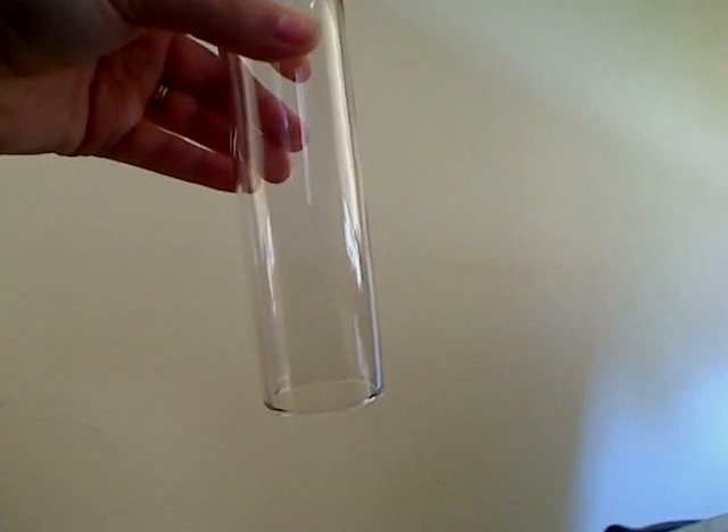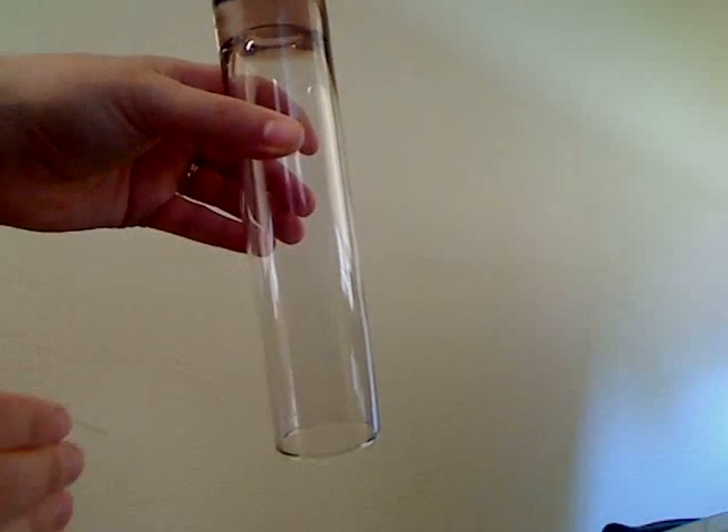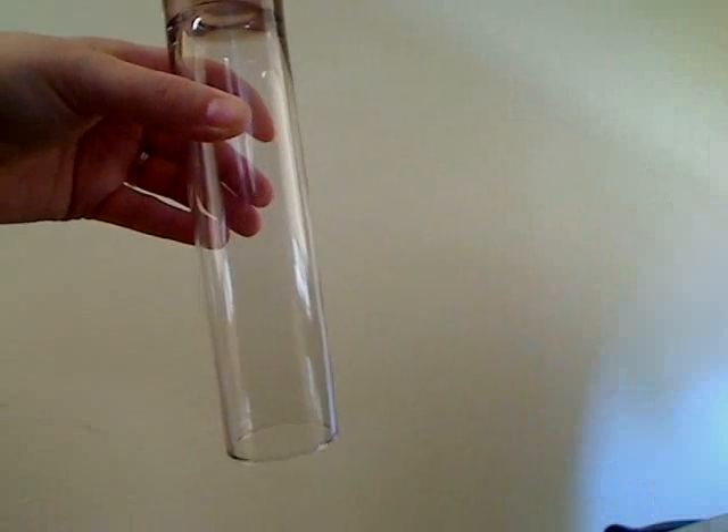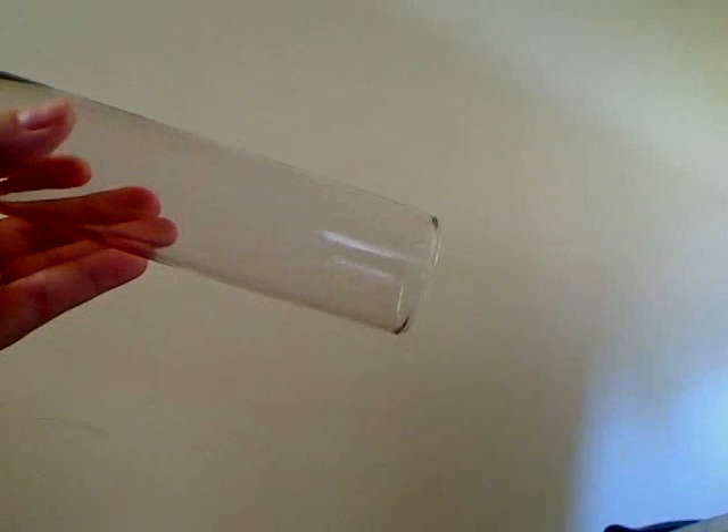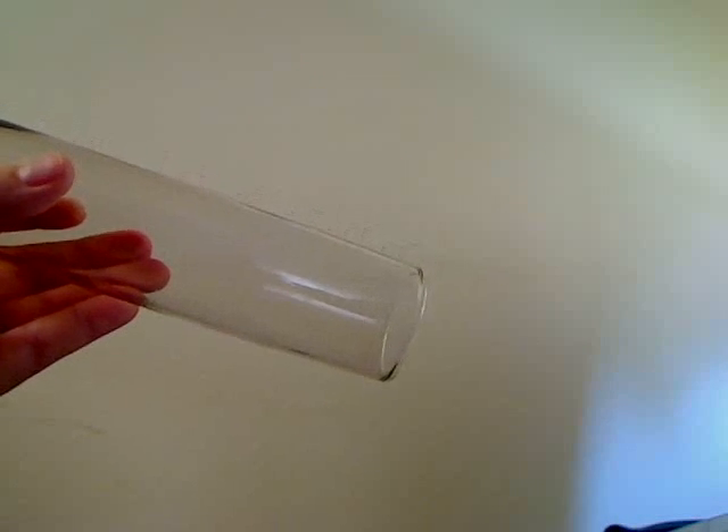So when you're inserting it, say you're looking at this from a side view — this here is your back and this here is your stomach. A lot of people think that their vagina goes straight up and down, but actually it goes back like this towards your rectum.